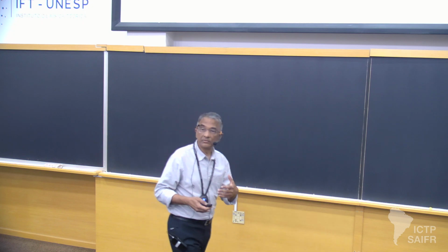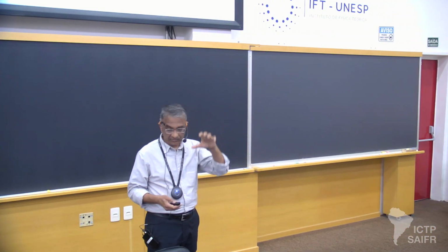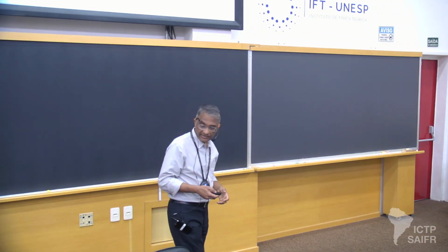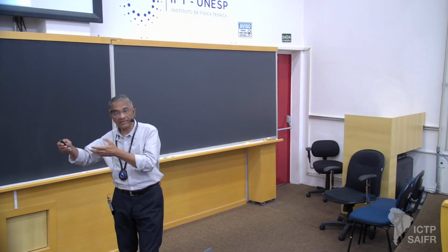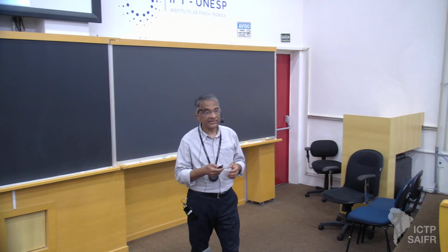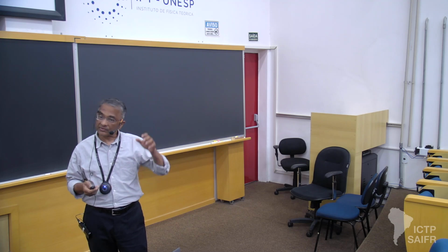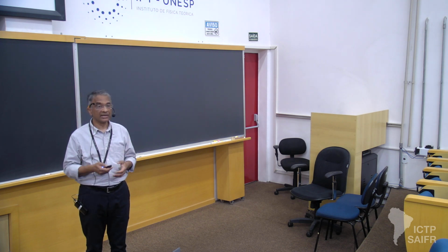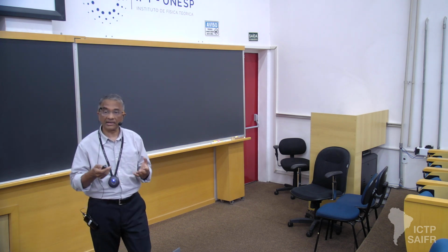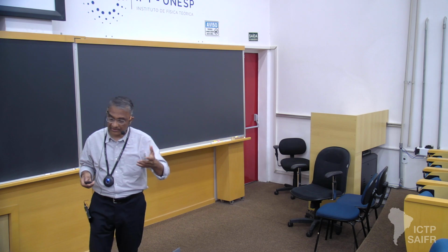I'm not going to talk about the imaging modalities. This has been presented by others in slides over the last several days, but the first three of these are true imaging. You get static images, and the fMRI and MEG give you short-term time series. While the person is in the magnet, you can get a capture of the brain activity. For us, of most use is the EEG, because here we can do long-term monitoring of the brain over days, weeks, if necessary, and that's when we can capture seizures. Seizures occur randomly, or nearly randomly, and they're spontaneous. There's nothing that tells us when a person's most likely to have a seizure, at least for clinical purposes, to be able to tailor just a short-term study with fMRI or MEG.